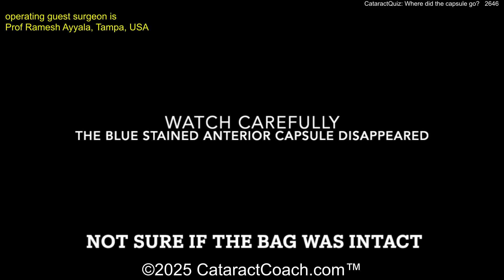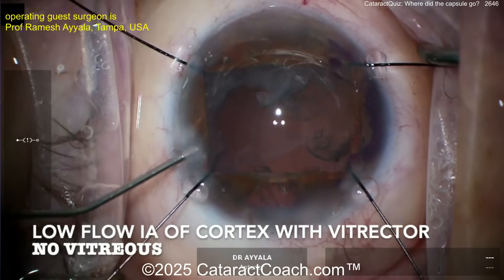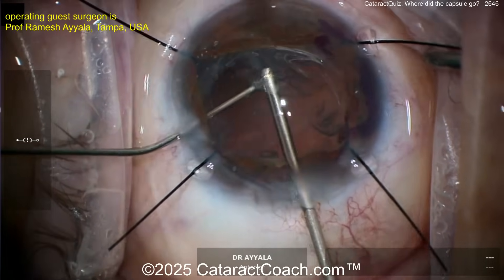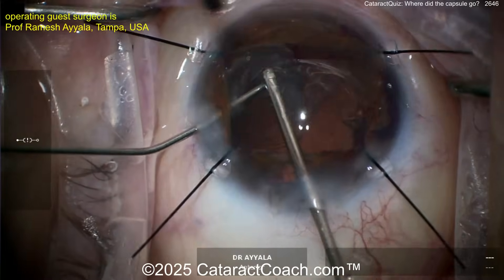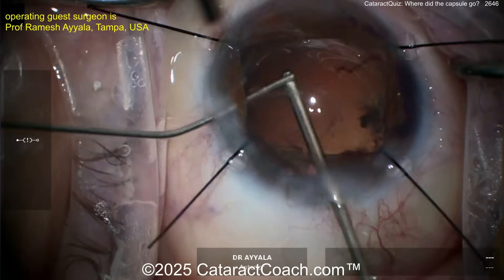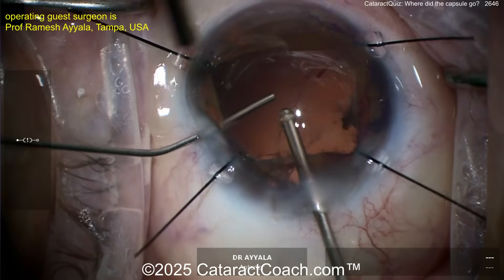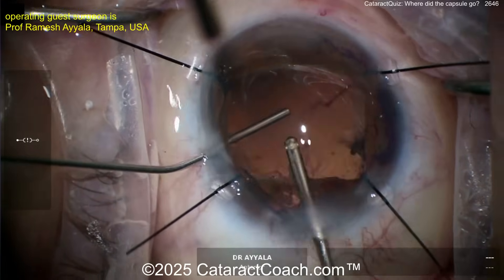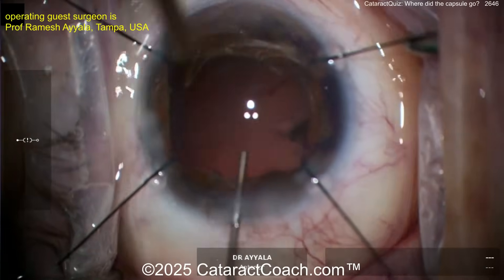Watch carefully — the blue-stained capsule is gone. You're not sure where the rhexis went. Now using low-flow cortex removal with the vitrector. There's no vitreous present yet — the vitrector is being used to take out the cortex in a bimanual approach: infusion in the left hand, aspirating through the right hand with the vitrector. Now it's cleaned up — and look at that. The bag looks like it's just gone. Where's the bag? You don't see the rhexis edge. The blue-stained capsule — where's it gone? Is there a posterior capsule intact? Visco going inside — now what?